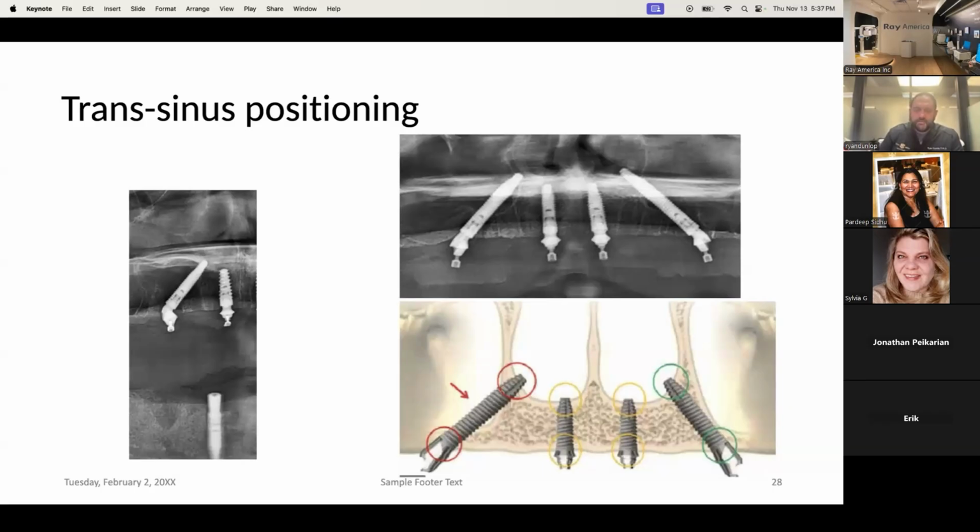So that's a term that floats around, where if you over compress the bone with a dental implant, somehow the bone will die back. And that just doesn't seem to be the case. Cases where I've seen actual necrosis around an implant are not from the compression, but from the overheating of the bone. So when you have a surgical guide that blocks your irrigation from getting to the osteotomy, or when you're spinning your drill inside an osteotomy and there's no irrigation getting deep under there, that's when you start to see problems. You can routinely put implants in. In fact, in my case today, I was putting implants in at 90 plus, all of them.